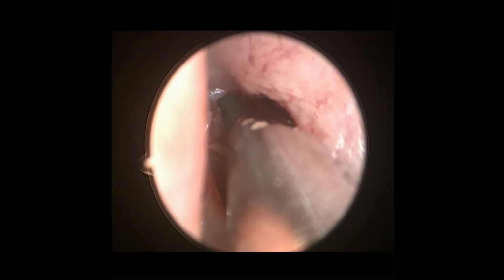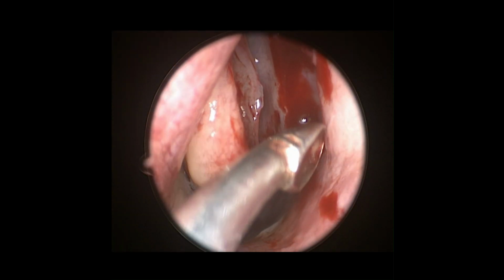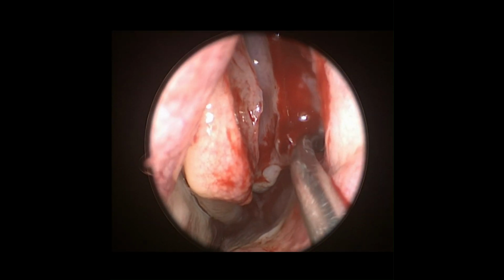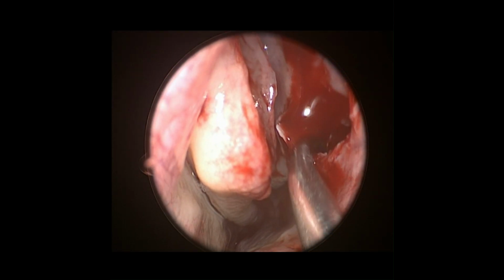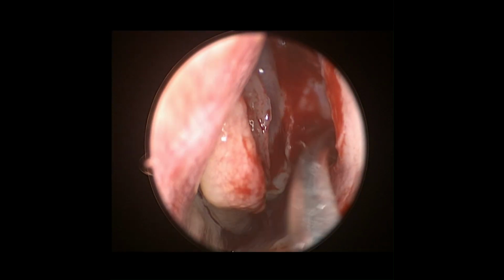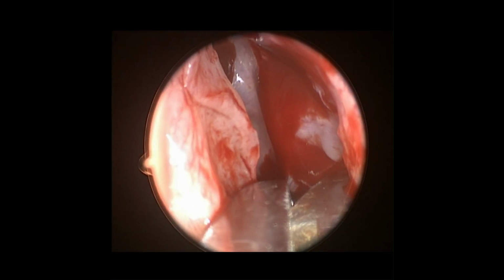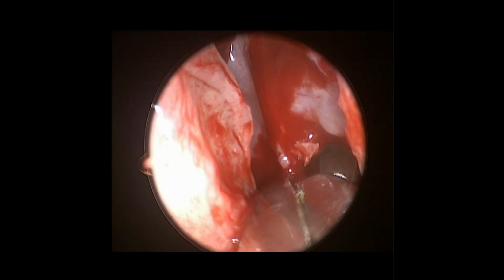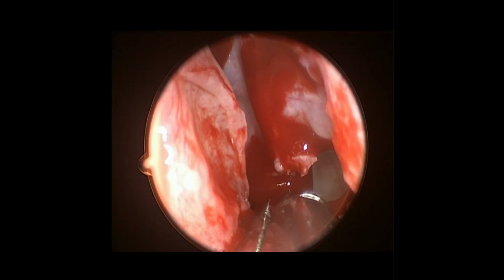the maxillary sinus antrum is identified with a J-curette by introducing it into the maxillary antrum in a posterior inferior direction at the anteriormost end of the horizontal uncinate. Do this step carefully to avoid injury to the medial orbital wall. Naturally, the maxillary ostium is always open very close to the roof of the maxillary antrum.